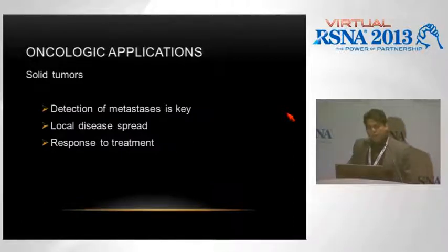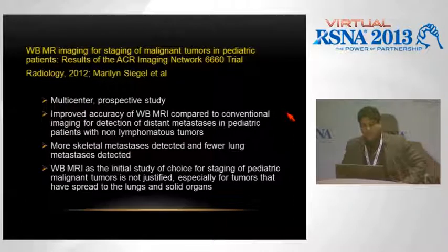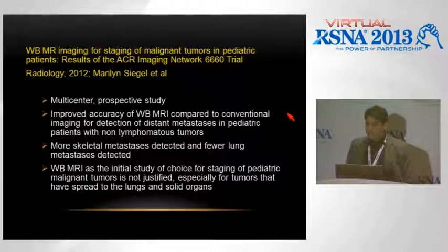What about the other oncologic applications with solid tumors? Detection of metastases is clearly key with this. Response to treatment is the main answer that we're trying to provide with the non-lymphomatous solid tumors. And I want to draw your attention to this multi-center study published in 2012, fairly recent again, where whole body MR was used for staging of the malignant tumors in pediatric patients.